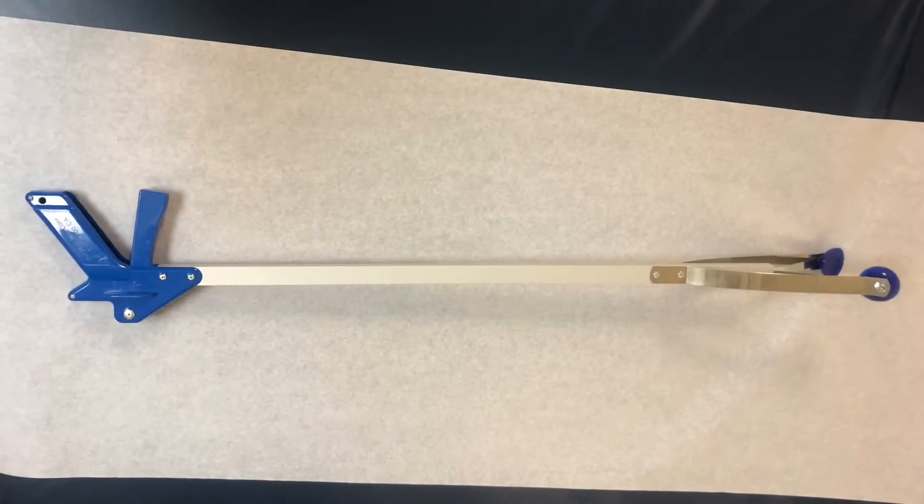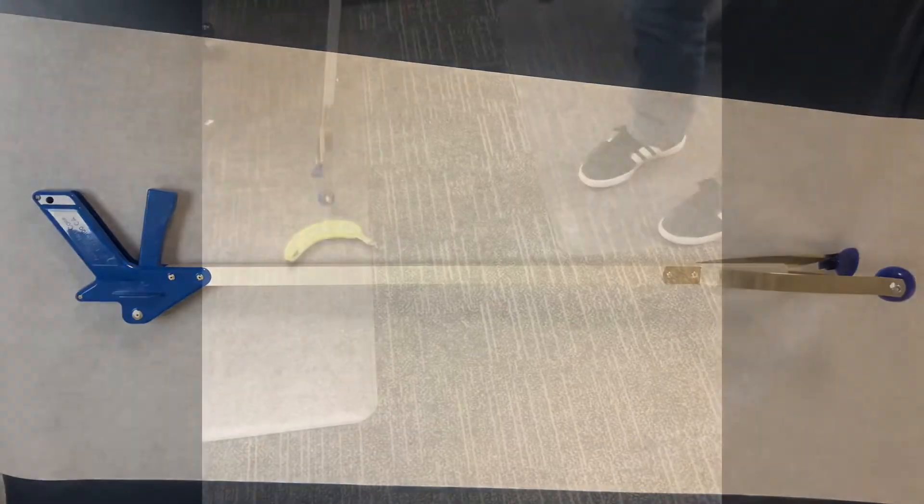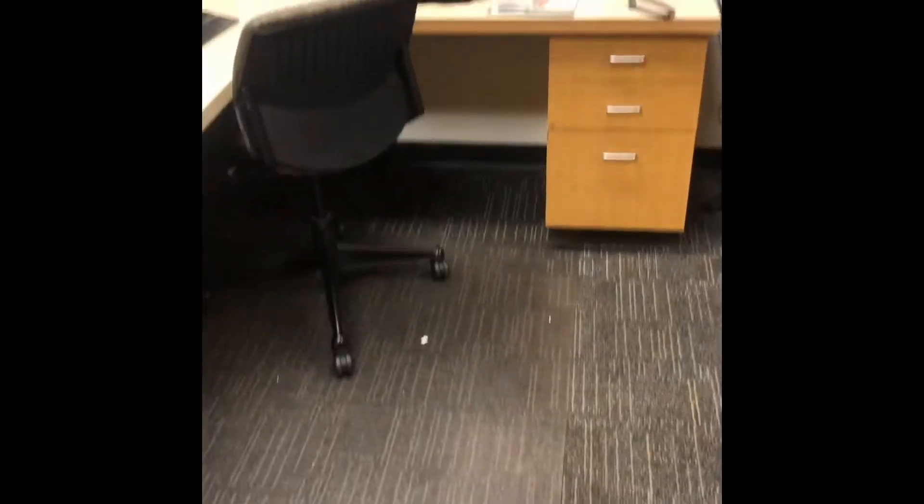The fourth adaptive equipment is the 32-inch easy reacher. This is a brief demo of someone using the 32-inch reacher.